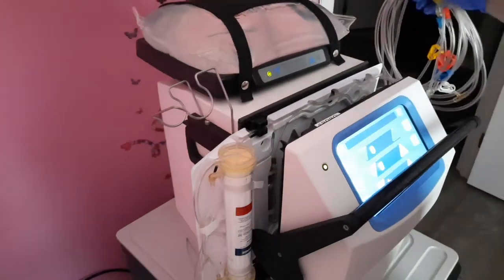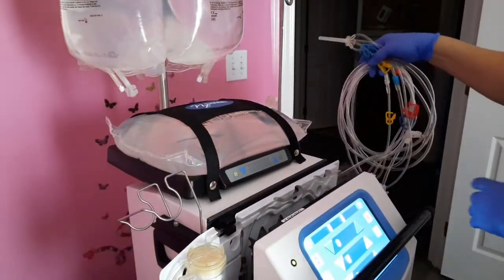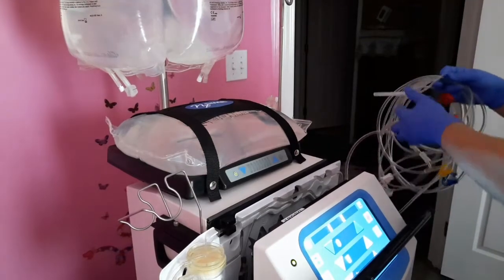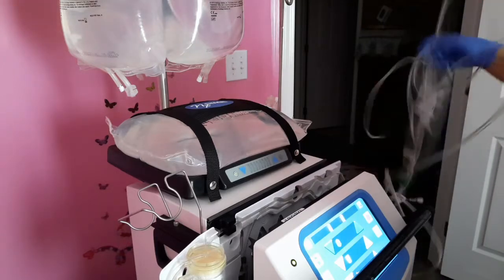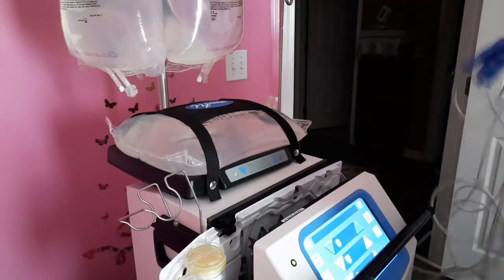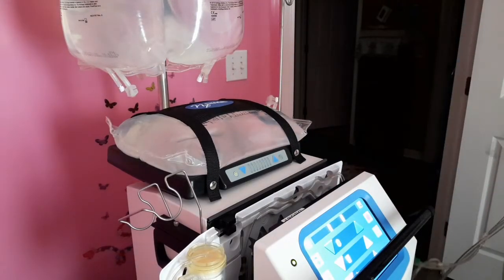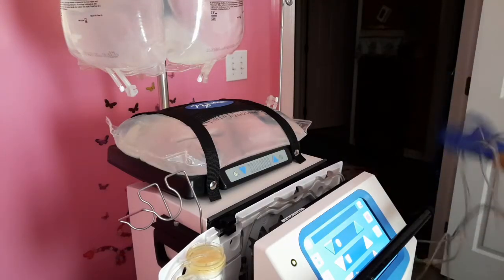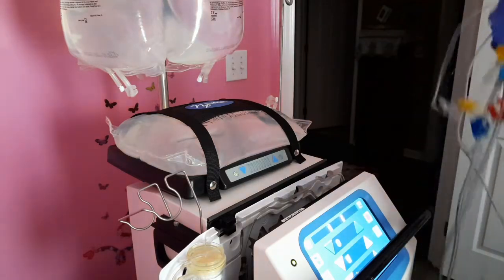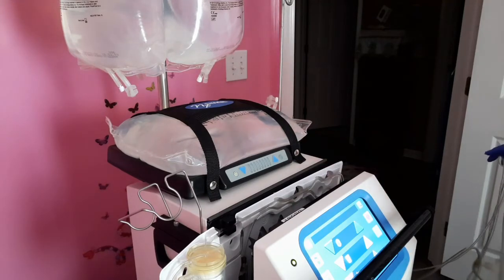So, what you're gonna do next is you're gonna take your line here and we're gonna unravel it as best as we can because holding the spike, this is your spike and it's sterile. You're going to loosen your lines. Okay? They do come all tangled and they do get tangled. Don't let that get to you. It's just part of the way they wrap them. It's not anything you're doing wrong. Okay? Sometimes they untangle beautifully and other times not so much.